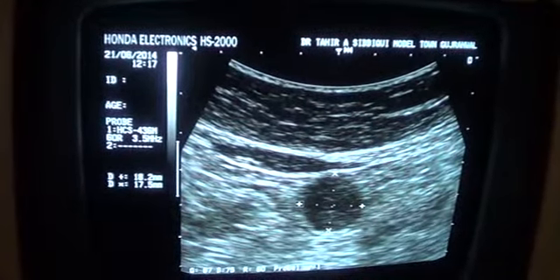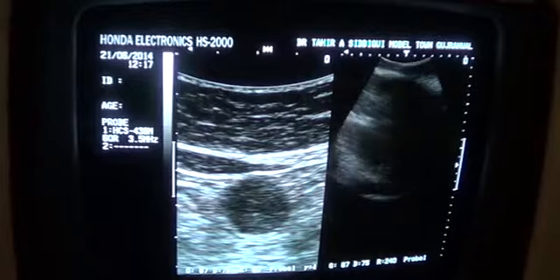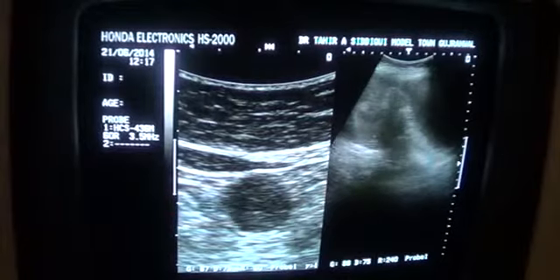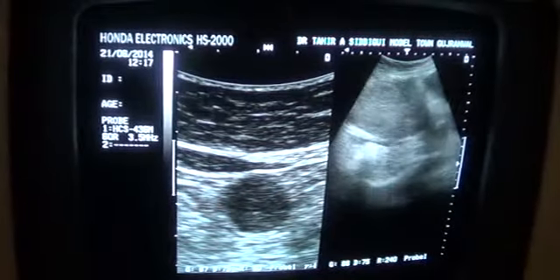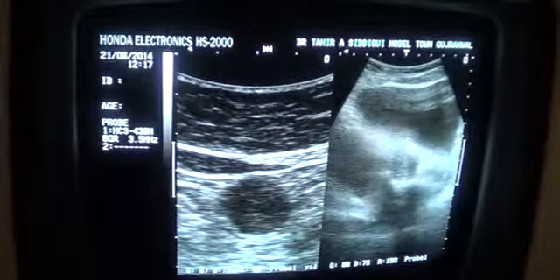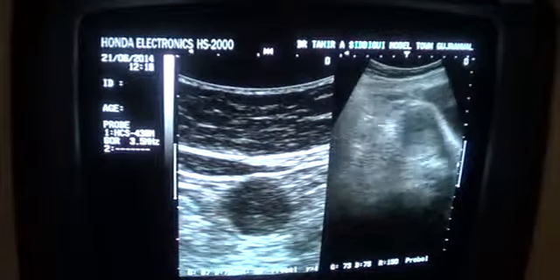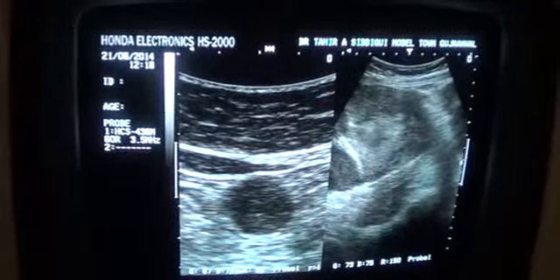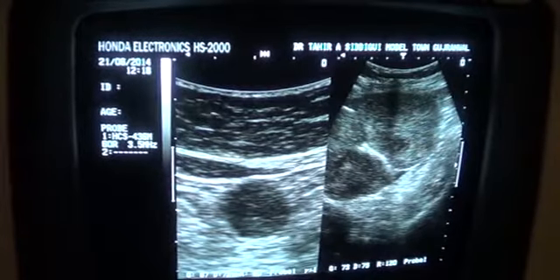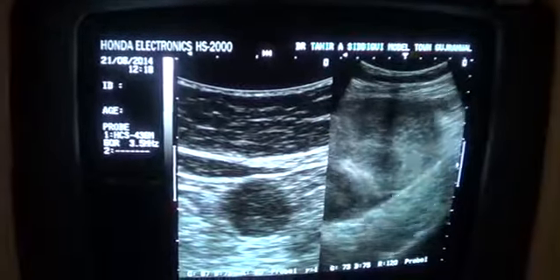So this is an adjacent lymph node to the mass that we have just studied. This is our case of the day, with fluid in the dependent region of the peritoneal cavity as well as the right paracolic gutter. See the complex nature of the mass. You can see a small amount of fluid also here, and a small amount of fluid over here as well.